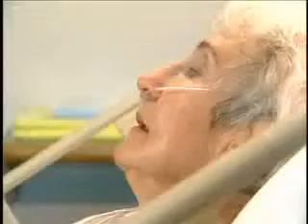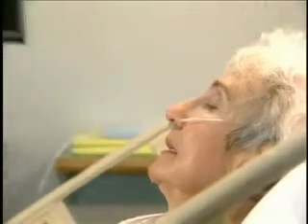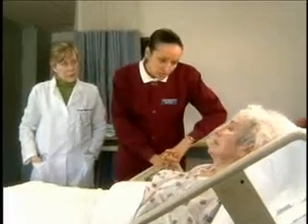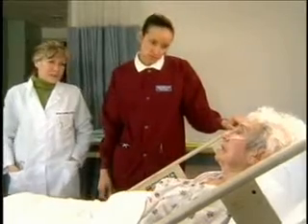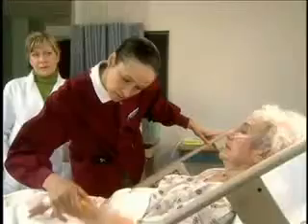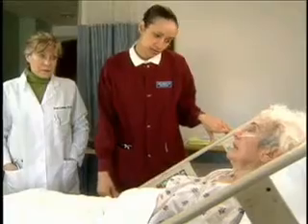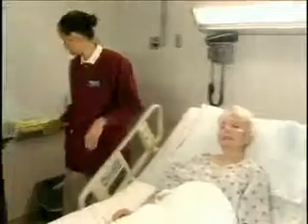Miss Marconi? Oh, hi, Anna. Hello. How are you doing? Okay. I'm going to help you get those secretions out of your throat. It'll be a little unpleasant during the actual suctioning. But once we're done, you're going to feel a lot better. This is my instructor, Miss Lewis, and she's working with me today. Hello, Mrs. Marconi. We're going to help you breathe easier. Okay, let me just take a look at your ID band. And can you tell me your name? Julia Marconi. Okay, just give me a moment to set up, all right?